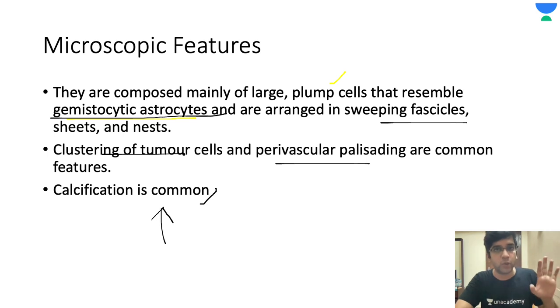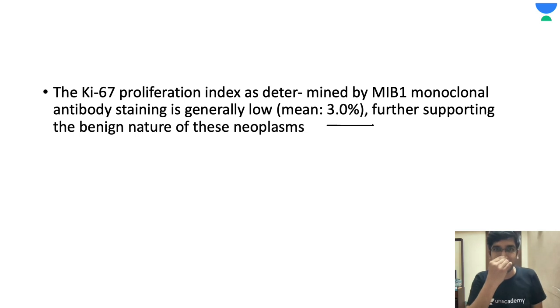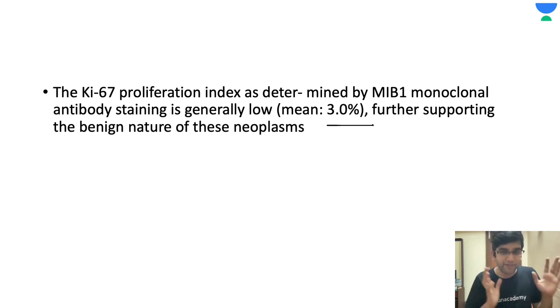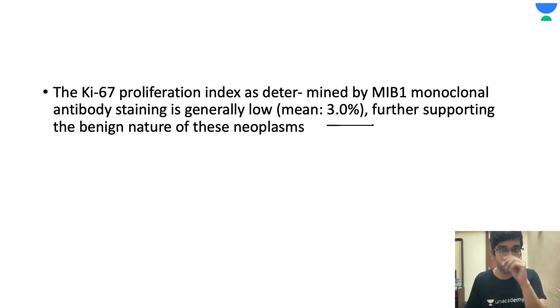To prove the low-grade benign nature, even if you do a Ki-67, the average Ki-67 is 3%. A grade three tumor would never have 3% Ki-67. Undoubtedly, it's a very low-grade tumor with an extremely good prognosis. So I have a preliminary diagnosis based on the fascicular arrangement, the spindle-shape architecture, and the pink cytoplasm — a preliminary diagnosis of subependymal giant cell astrocytoma. Now I have to prove it.